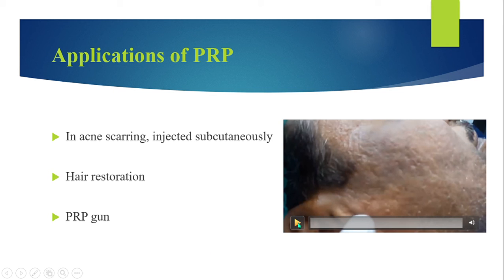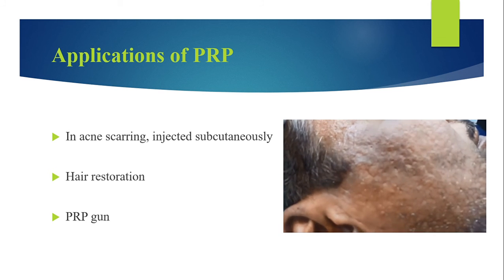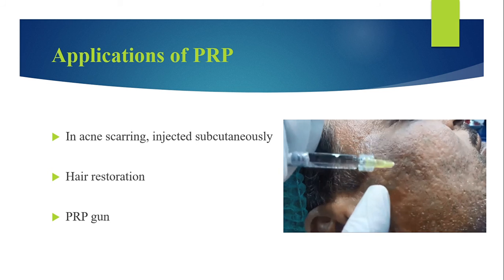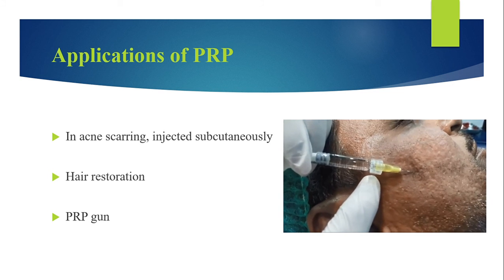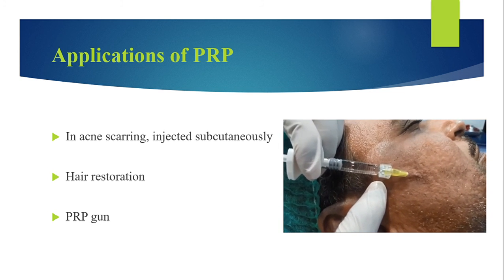So some applications of PRP, in acne scarring, it is injected subcutaneously. You can see the plasma being injected intradermally into the scars.